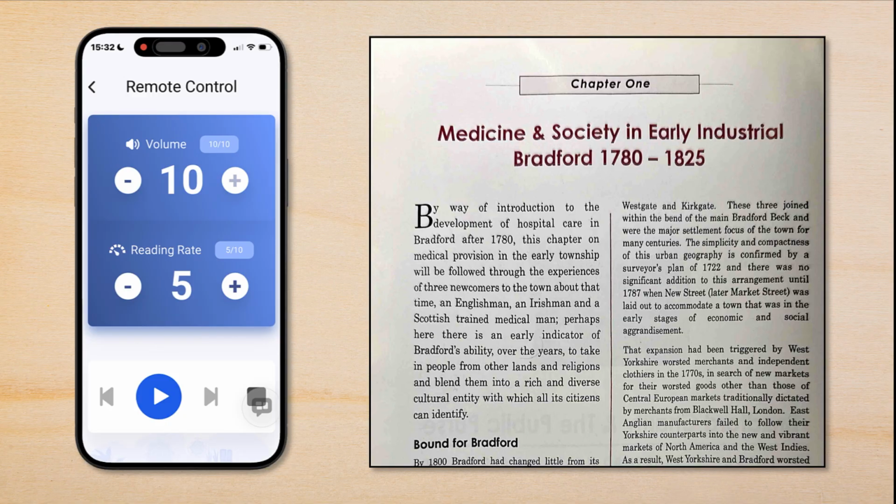So this is quite good if you just want to sit back, relax, and have your OrCam read a document to you. You can't use the app to initiate a scan of a document. To do this, you still need to either press the trigger button or use the voice commands.